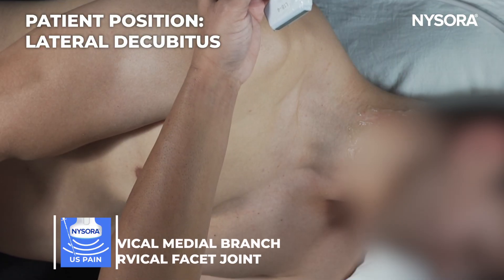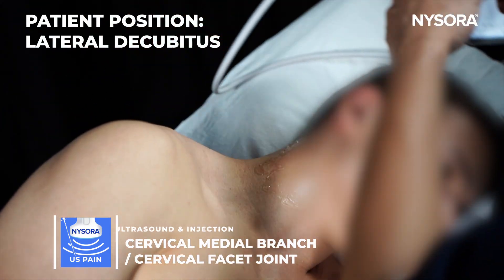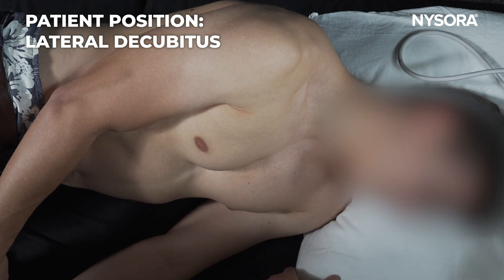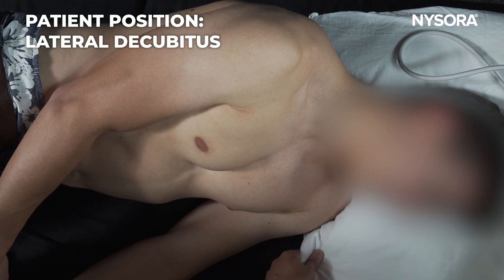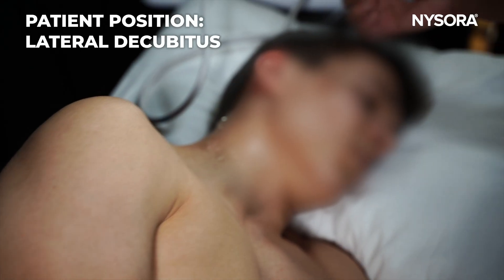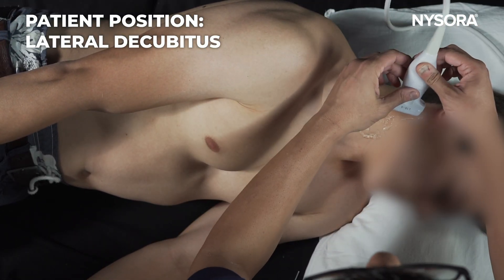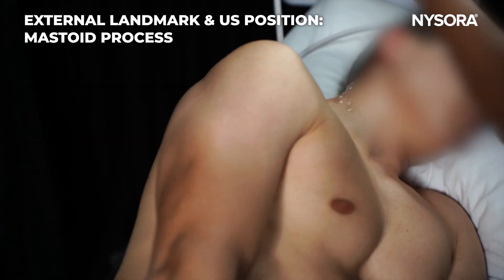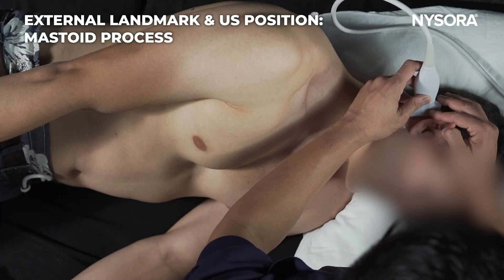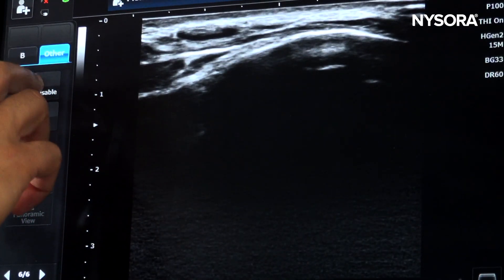Now I'll show you how to scan for the cervical facet joint injection and cervical facet joint medial branch block with the patient in the lateral position. Position the patient laterally and use a pillow under the shoulder. If the patient has a short neck, ask them to reach for their knee to pull the shoulder down, giving you maximum operating area. The first step is to feel for the mastoid process and place the ultrasound probe on top of it.